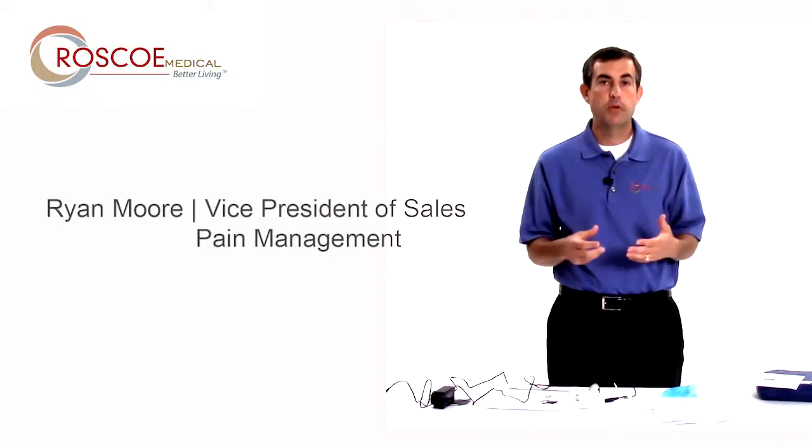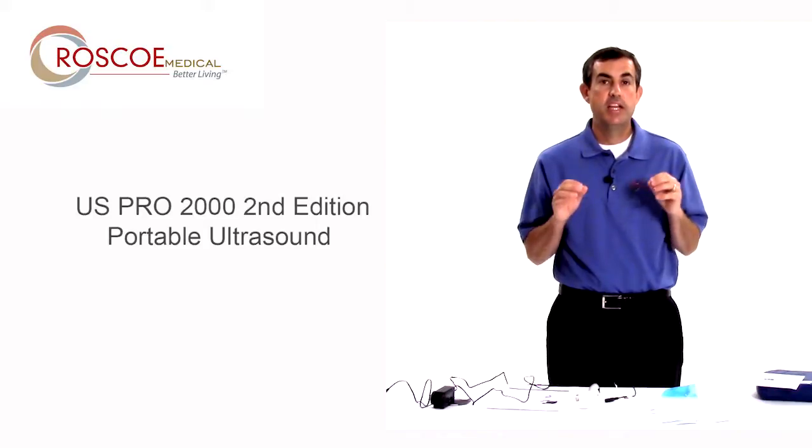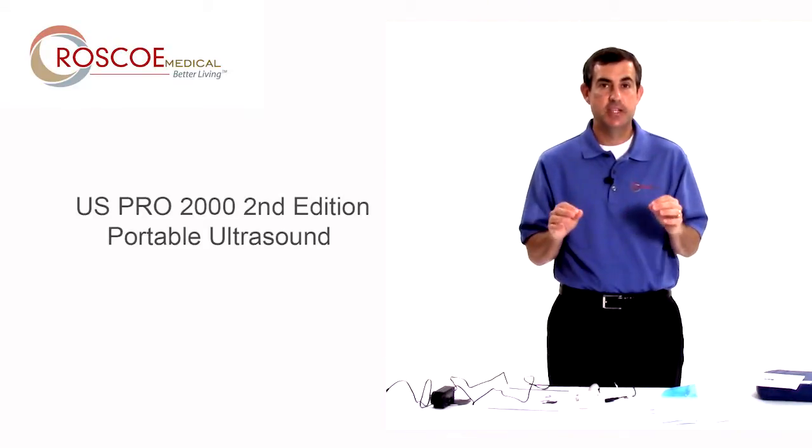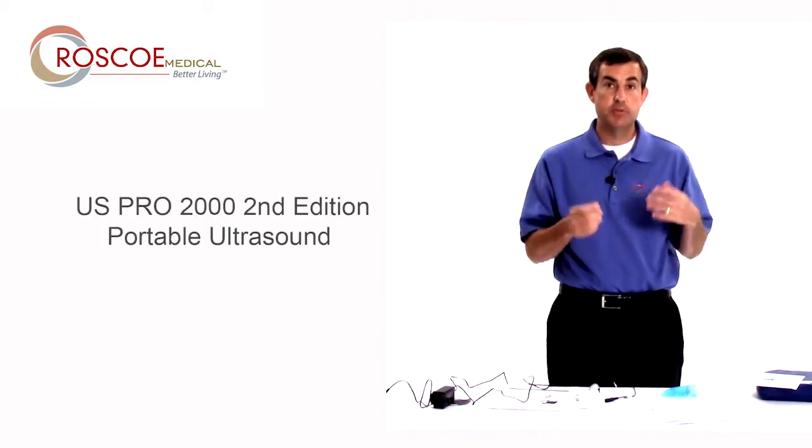Hello everyone, it's Ryan Moore with Roscoe Medical. I'm here to tell you about the US Pro 2000 2nd edition. This is a how-to video on how to use your device, but I want to briefly go over the differences between the first edition.